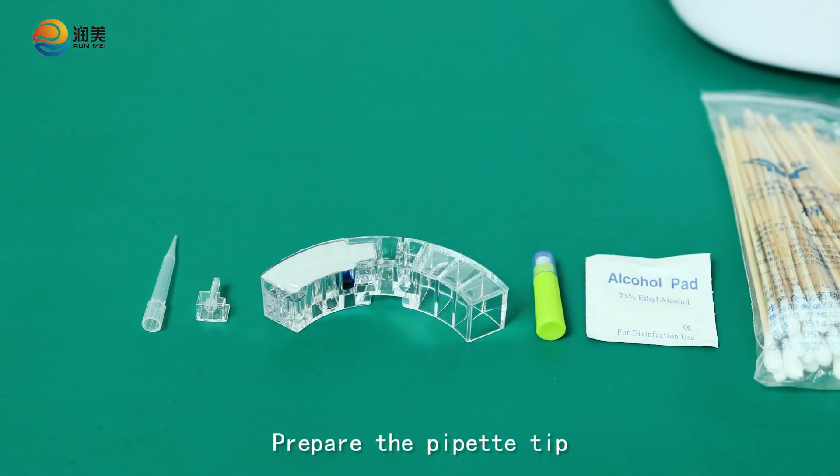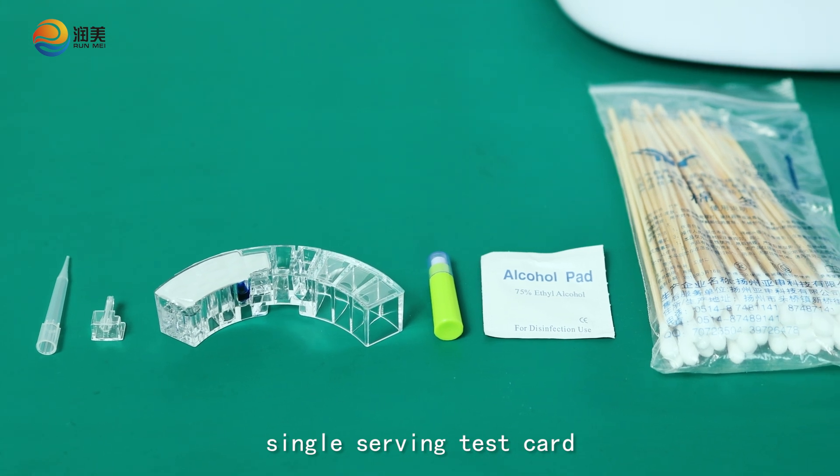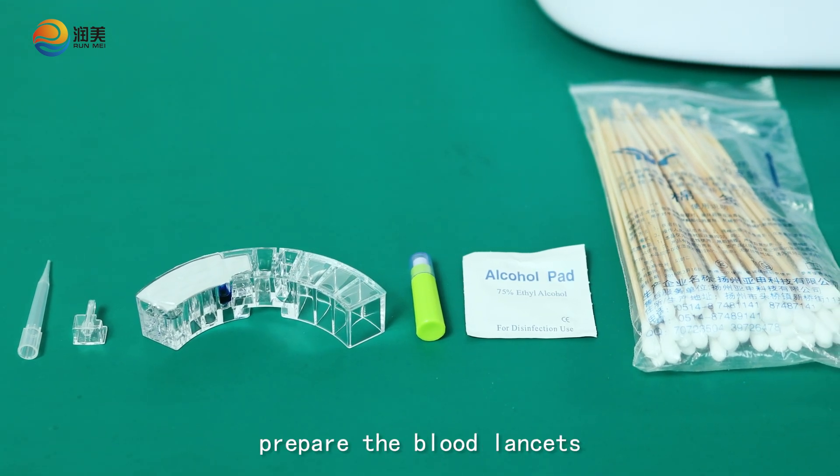Prepare the pipette tip, sampler, and single-serving test card. In addition, prepare the blood lancets, alcohol wipes, and cotton swabs by yourself.